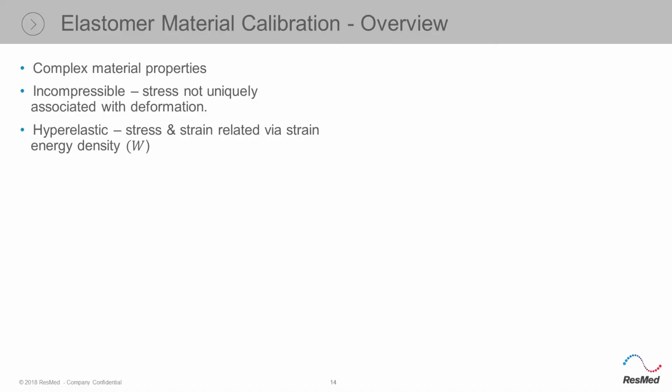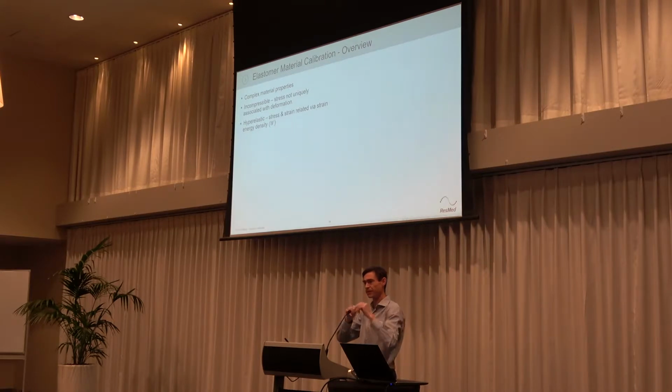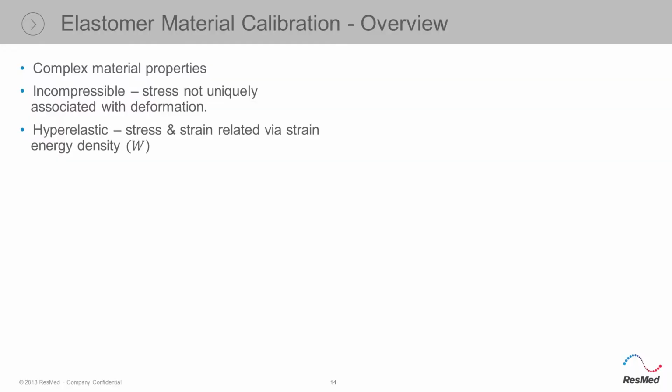Brought one. This is one we actually used for this particular project. They're very stretchy. They eventually lock up, so they're highly nonlinear. One of their quirks, and one of the reasons it makes them fun to model, is that they're essentially incompressible. So that makes for some mathematical conveniences, but it also means the whole linear theory falls over and we have to use hyperelasticity or some other methods to solve them.